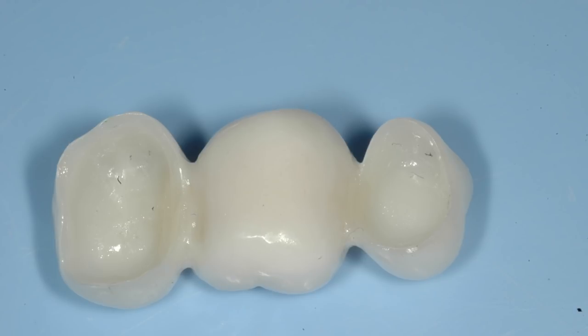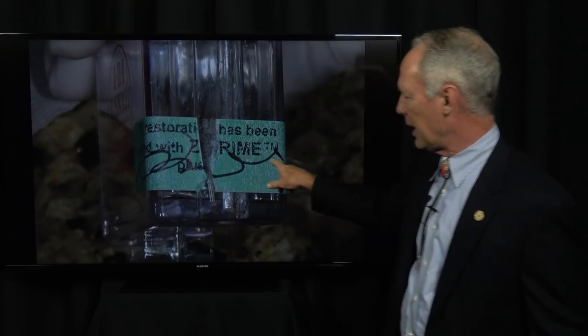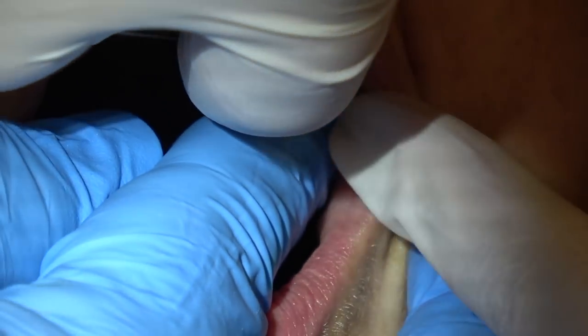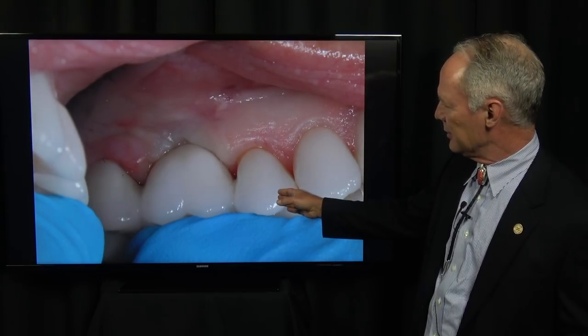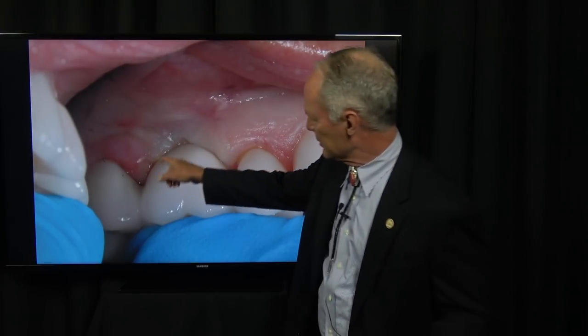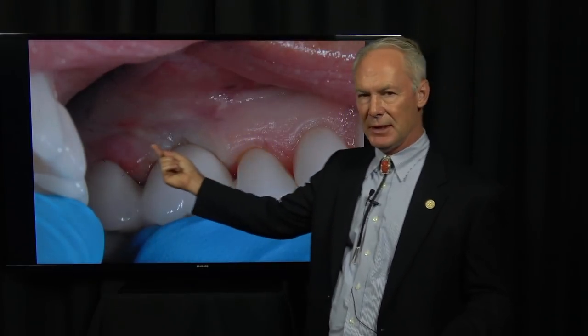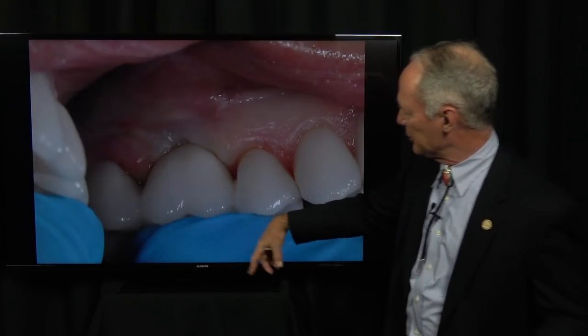I like porcelain to zirconium for these bridges, and we prime that with Z-prime. I'm going to try the bridge in place — this is out of the box, cleaned and into the mouth. You can see there's no interproximal contact adjustment needed. This is very important: see how the tissue is blanching? Sometimes the crowns won't seat — the retainers won't seat completely. You've got to hold it in place just a little while and let that tissue compress.